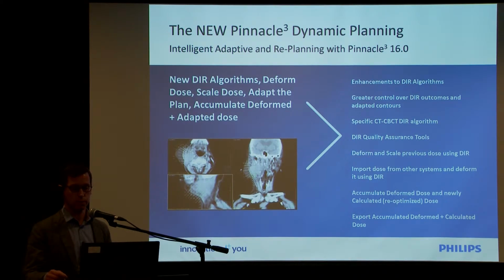There are enhancements to the DIR algorithms, greater user control over the DIR algorithms as well, and we have specific algorithms for CT and CBCT, so cone beam CT algorithms. We also have quality assurance tools, QA tools, and we can scale and deform previous dose using DIR, also import dose from other systems, and deform it as well, and accumulate that dose on the newly calculated data set.